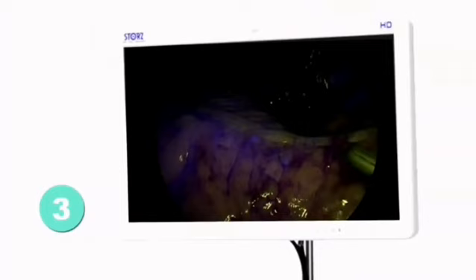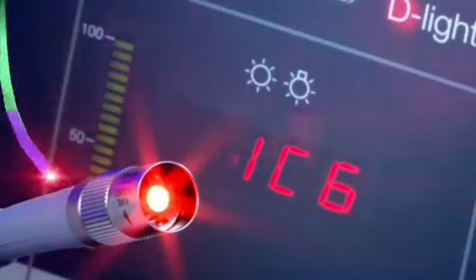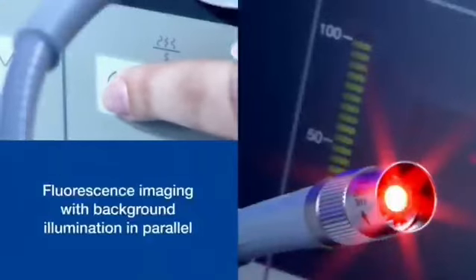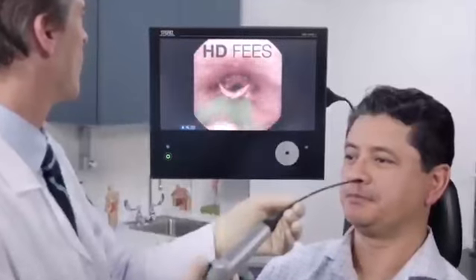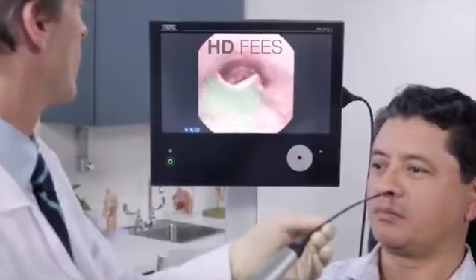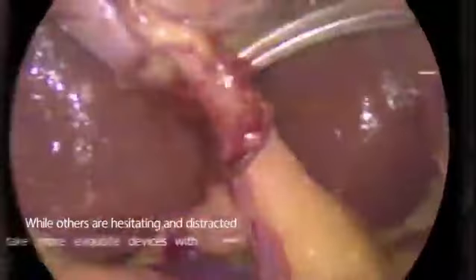Now let's look into how modern endoscopy works. Endoscopes use optical fibers to produce an image of inside the body. A doctor can insert a bundle of optical fibers into the body. Some carry light into the body, and some carry light reflected off internal body surfaces back out. This allows the doctor to see an image of the inside of the body clearly and help them diagnose diseases like cancer or see what they are doing during keyhole surgery.